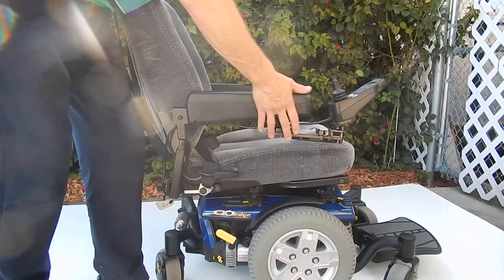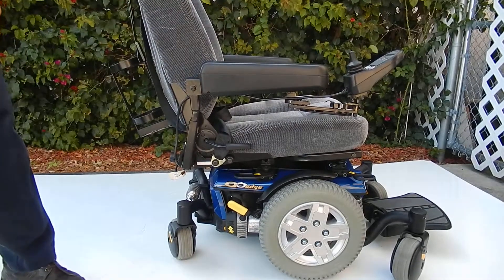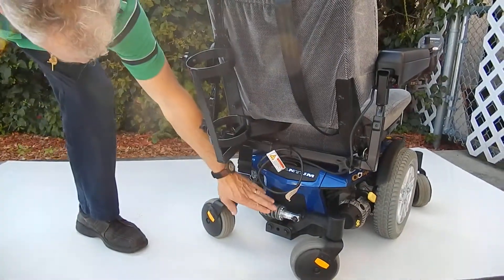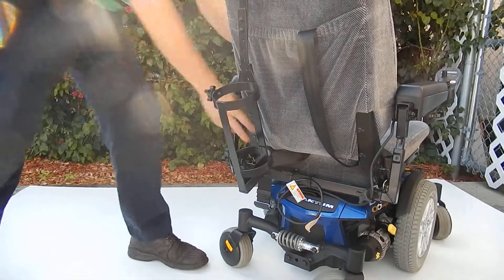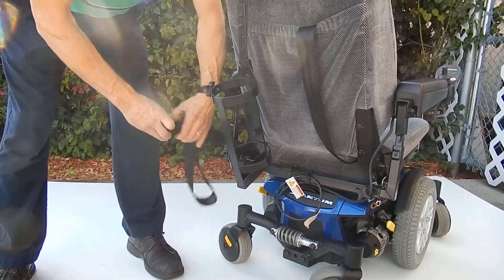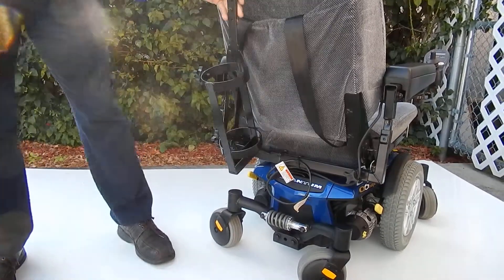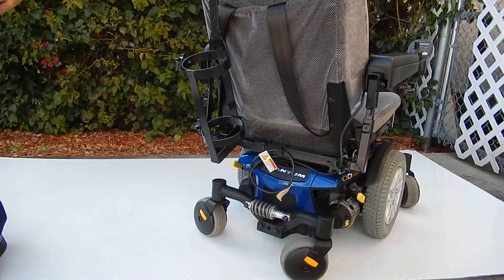The arms are also adjustable up and down, and they can also go out depending on the size of the person. There is additional suspension in the back for a better ride. This chair is equipped with a safety belt and also has an oxygen holder, which is stored in the back pouch and can be removed. This is a fantastic riding chair.